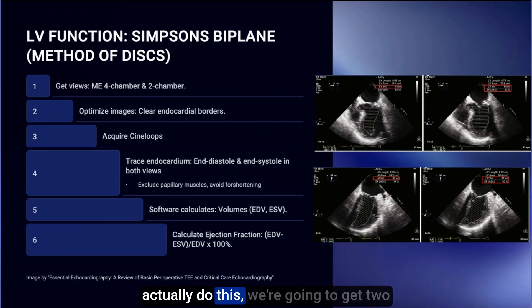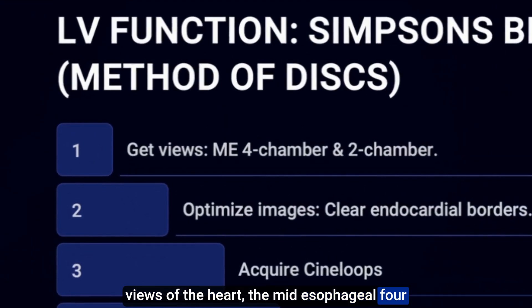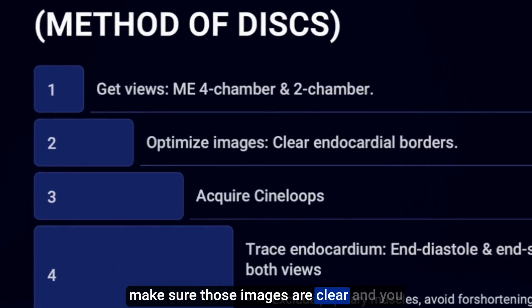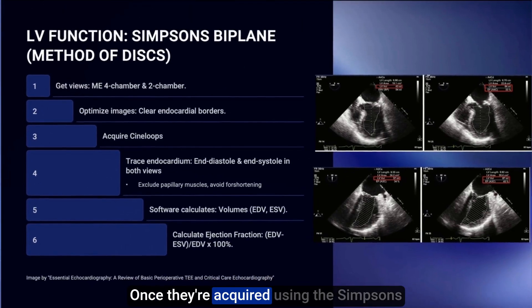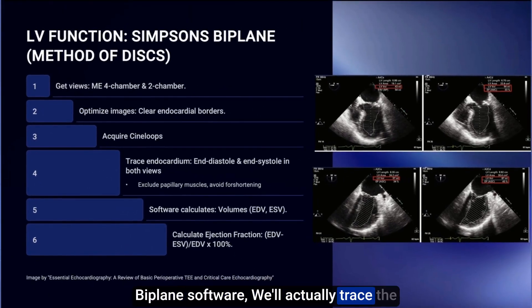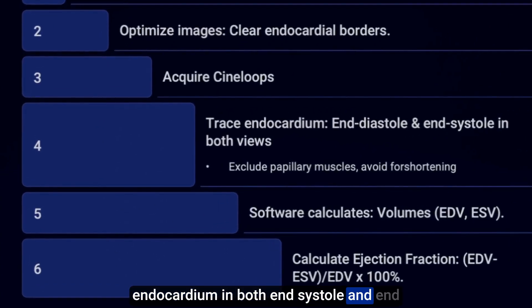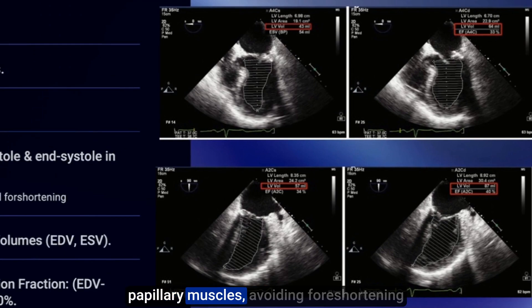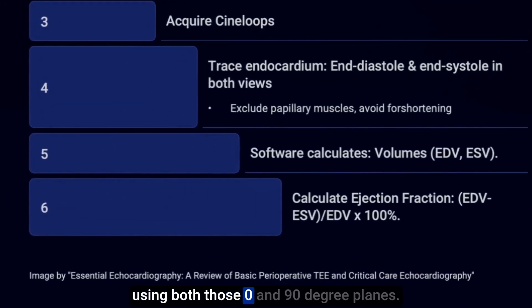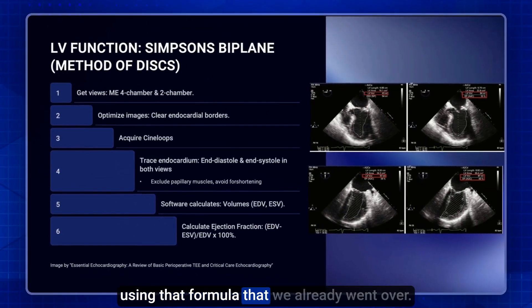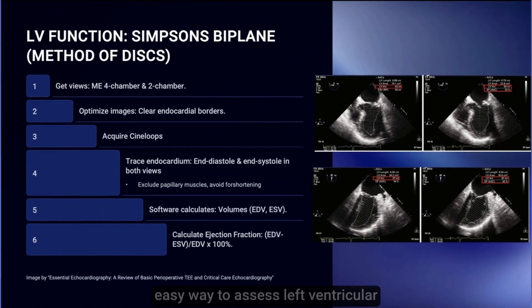Step by step: acquire two views — the mid-esophageal 4-chamber and the mid-esophageal 2-chamber. Make sure images are clear and the endocardial borders are identifiable, then acquire cine loops of both. Using the Simpson's biplane software, trace the endocardium in both end systole and end diastole of each view, excluding papillary muscles and avoiding foreshortening. This gives you an end diastolic volume and an end systolic volume using both the 0- and 90-degree planes, and the software calculates the ejection fraction from those values.